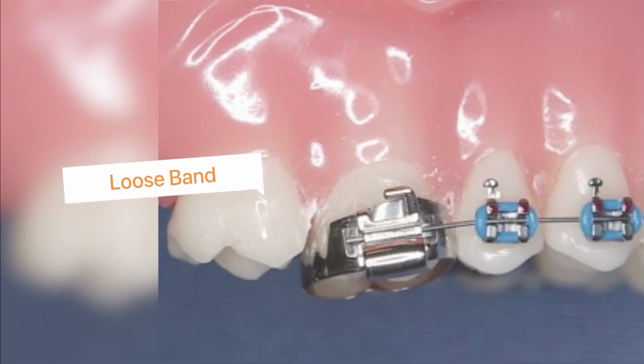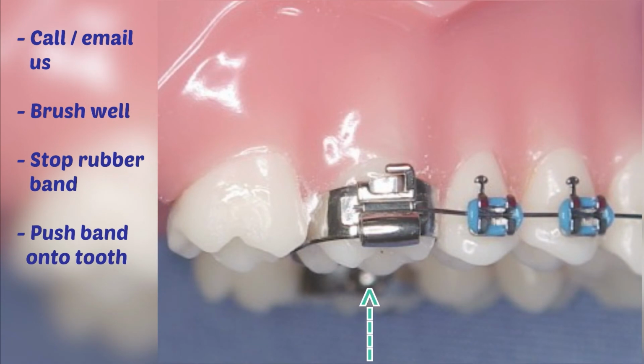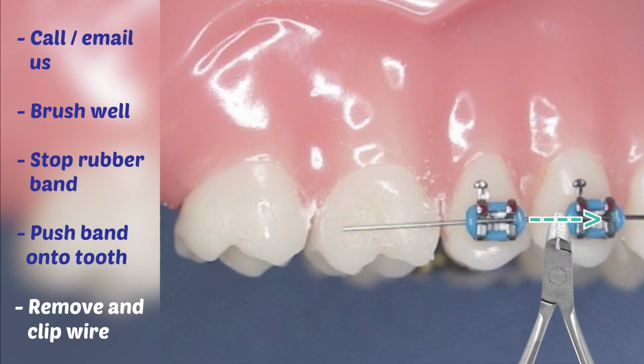If you notice your metal band is loose or moving on your back teeth, call our office so we can set up an appointment. Brush well around the area and stop wearing any rubber bands that hook onto these metal bands. If the metal band is not very loose, you can push it back onto the tooth in the meantime. If the band is very loose, then you can remove it from the tooth using your fingers. You may need to clip the extra wire as we've shown you earlier.